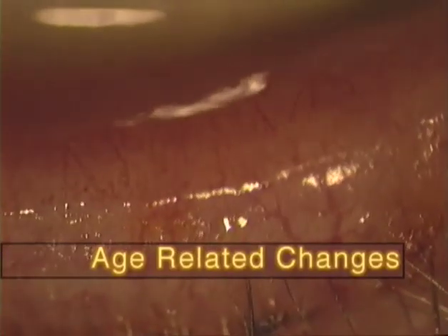At the cutaneous part of the lid margin, the large vessels are usually barely visible because they are buried under the hazy cutaneous epithelium. In old age, however, as for example in the case here, the large vessels in the cutaneous part may become visible and may run even across the border. Sometimes capillary neoformations are formed between the two networks right at the edge of the lid margin.